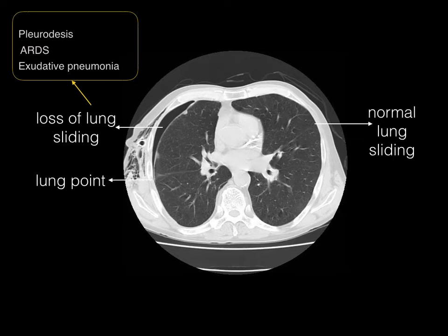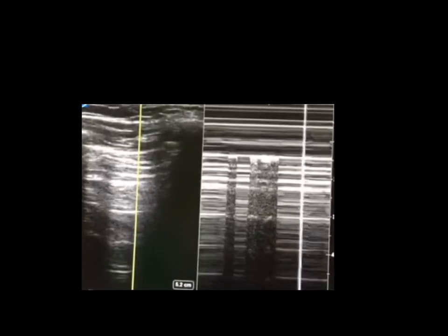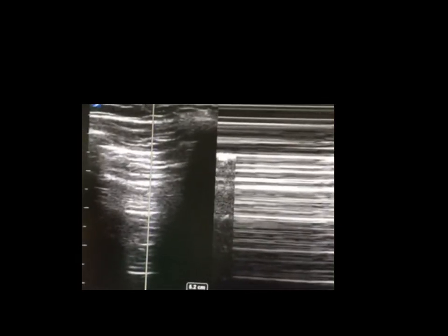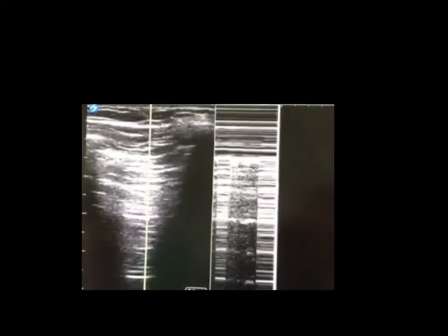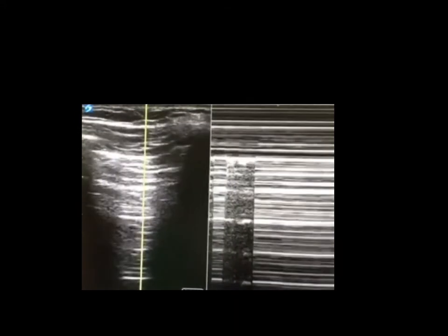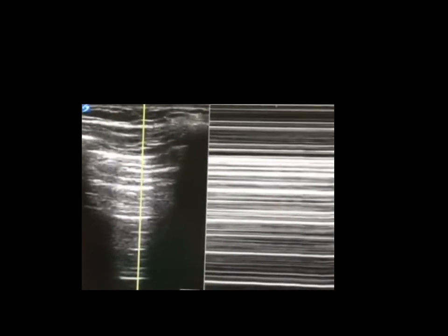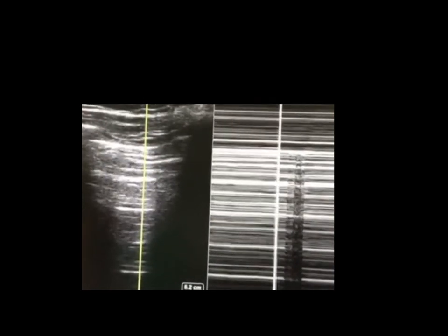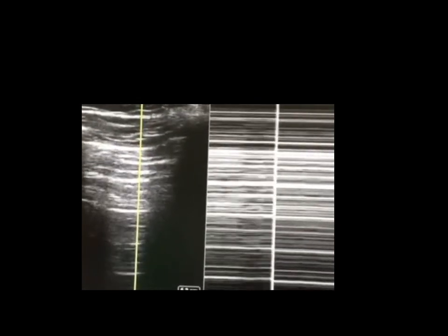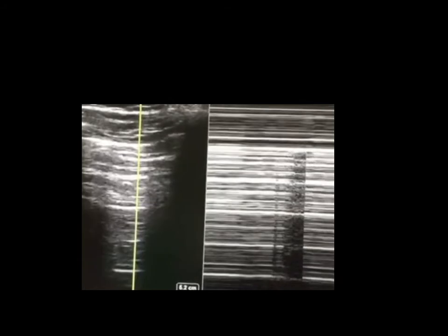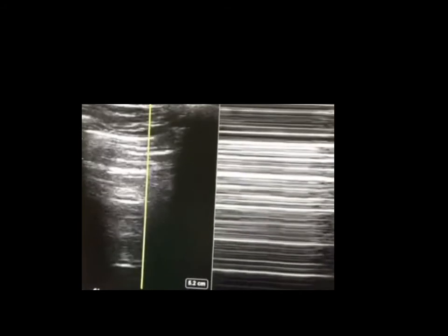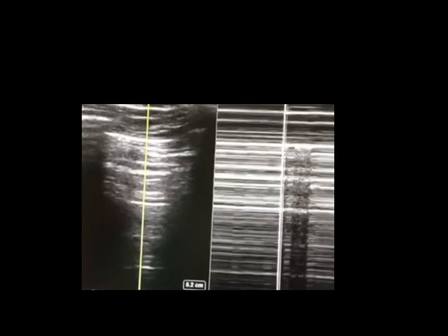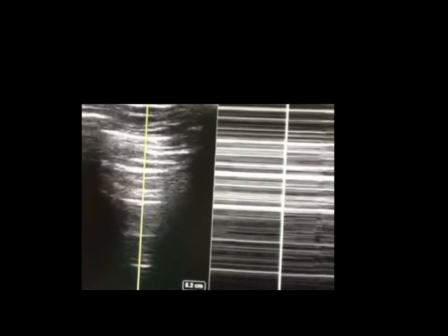As you can see here, when there is pneumothorax, the loss of lung sliding produces a barcode sign in M-mode. And then — there you go — there is a stripe of the seashore sign appearing on the barcode side again.